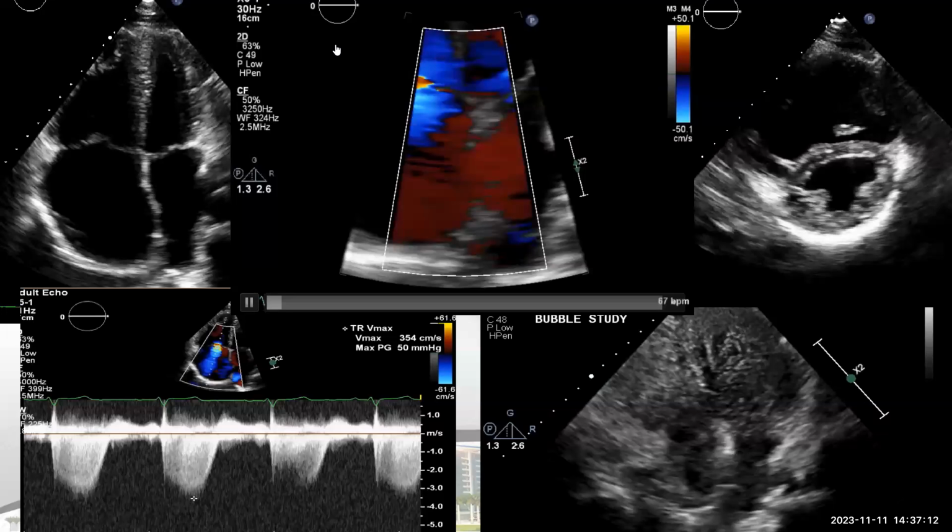And commonly we see patients with dilatation of the right side of the heart, and they don't have any shunt by color and they don't have bubbles. Why? Because there is equalization of pressure inside the left atrium and right atrium, and a very big secundum ASD. That's why we don't have color between them. So yes, it is an intracardiac shunt. Yeah, this is intracardiac, of course. This is a big intracardiac shunt. This is called sinus venosus atrial septal defect.